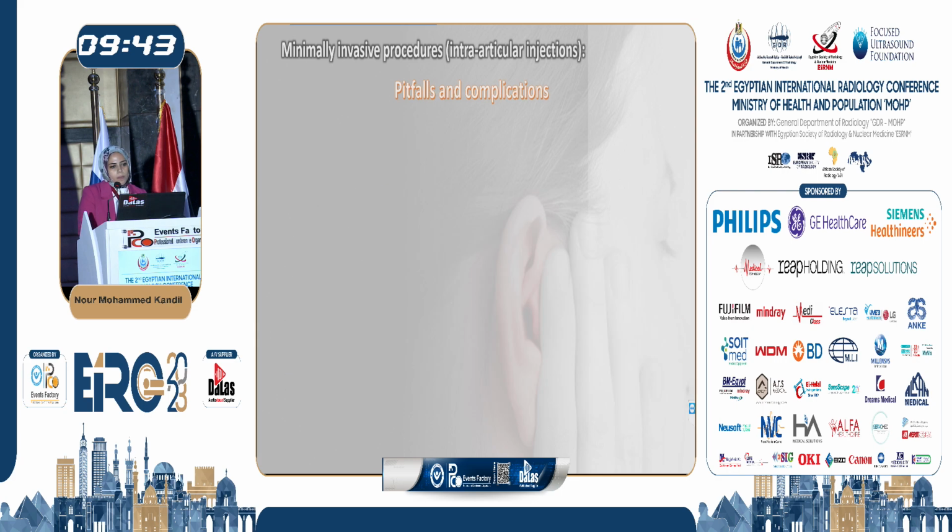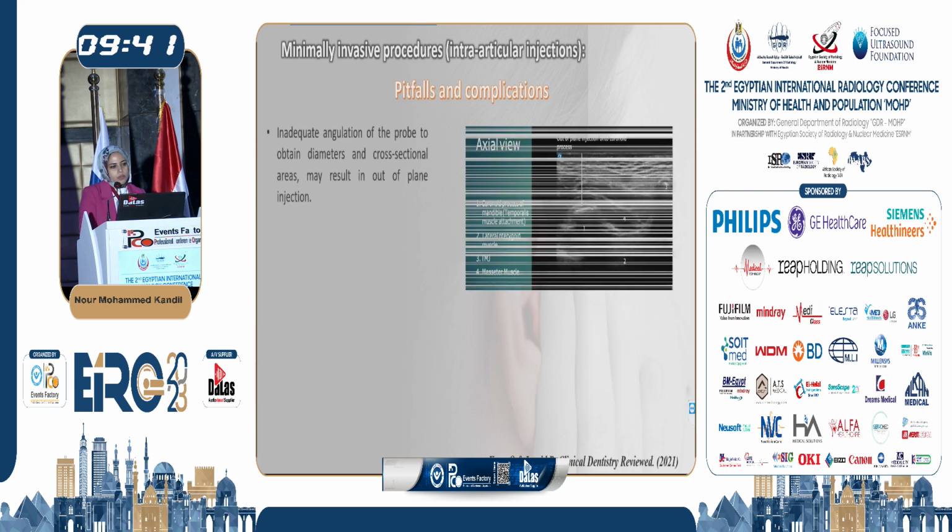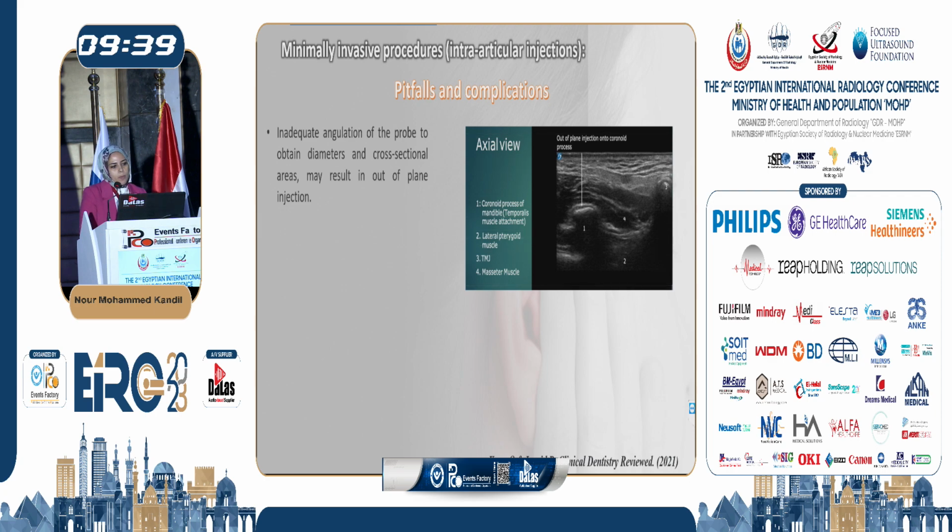The pitfalls and complications of intra-articular injections could be inadequate angulation of the probe, which may result in out-of-plane injection, and temporary pain or swelling of the affected joint. In some patients, facial muscle weakness, numbness, dizziness, or allergic reactions can be seen.